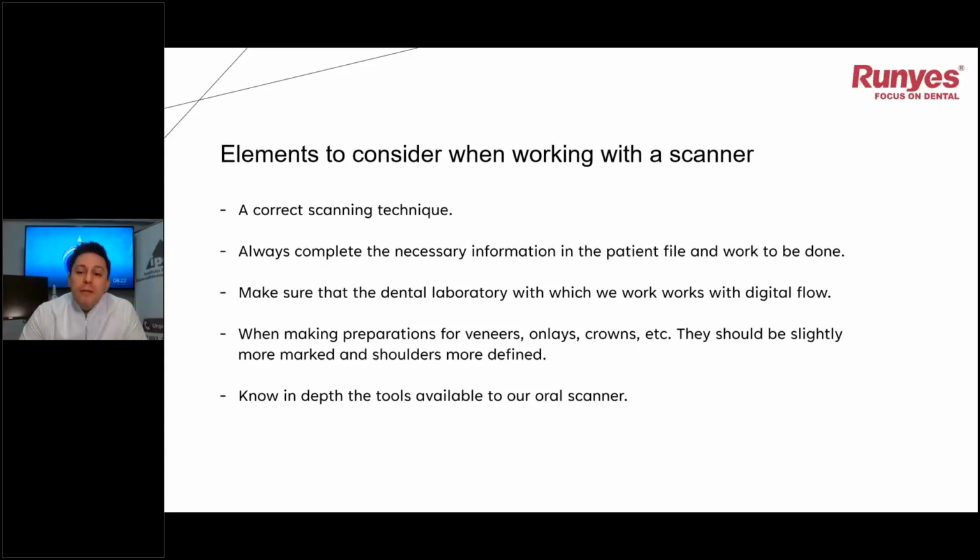Always complete the information that the software asks us for, because the more information we feed to our software, the better the scanner will know where to scan.